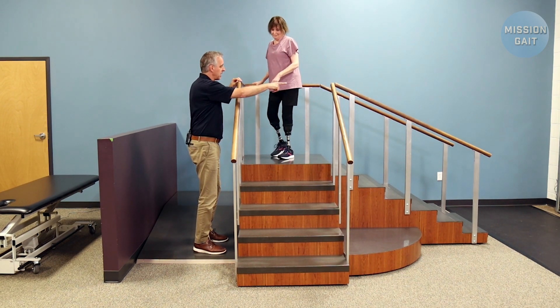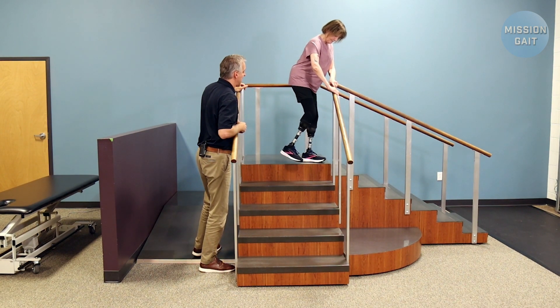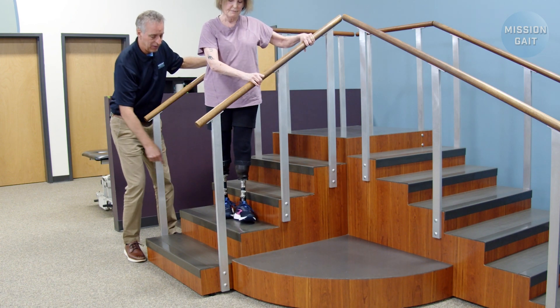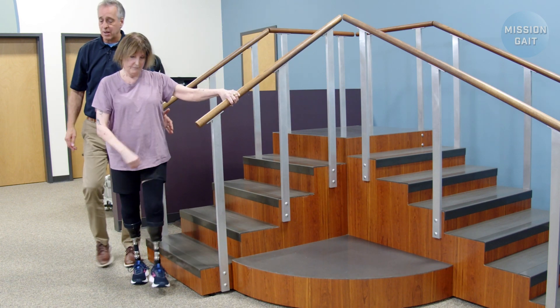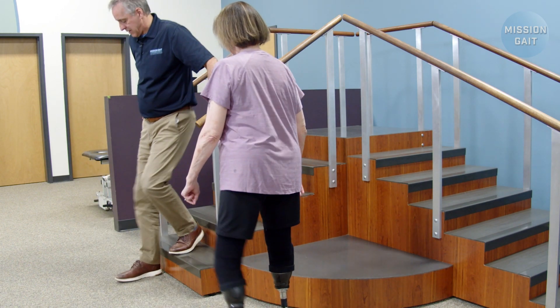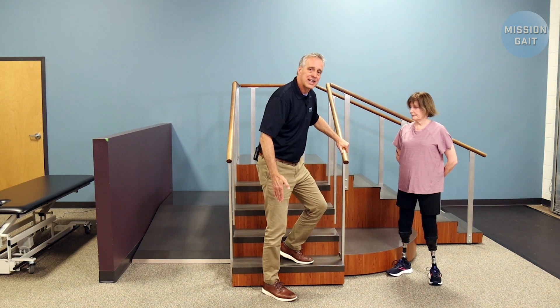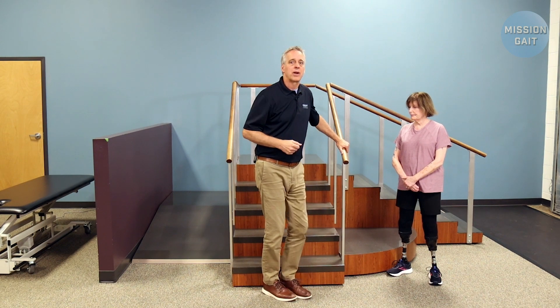If you're turning around and coming down the same side, step out and make sure you clear enough room to bring your other foot down. Step wide and then narrow. Notice when you come sideways too, that knee is less likely to buckle. If you step down to the front, your knee bends forward and it's easier for it to buckle. If you turn a little bit sideways and step down, you're putting more pressure on the outside of your knee where it doesn't bend, and it creates natural stability. So if someone's a little bit weaker getting started, that's a great place to start.